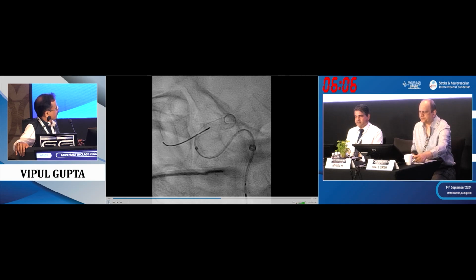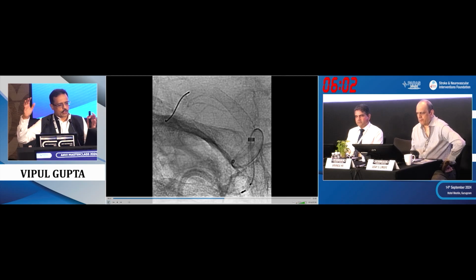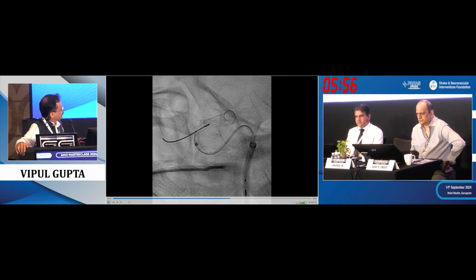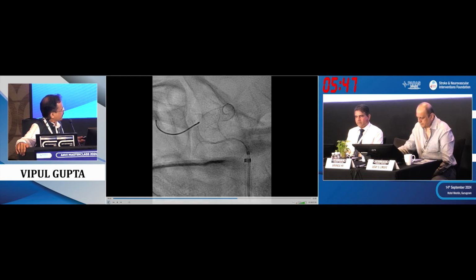We withdraw the microcatheter and we push it very hard, and somebody should be pushing in the guiding at the same time for it to really work. And we try to get even a dark line here, expand it as much as possible in the region of the blister. Again, another of those procedures. So we have really compacted here, expanded here. Now we can see, we take an angiogram, good wall apposition.